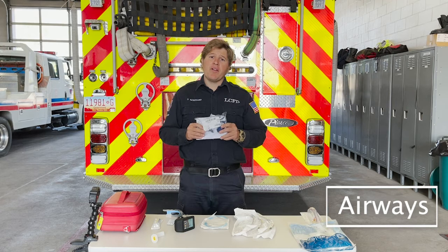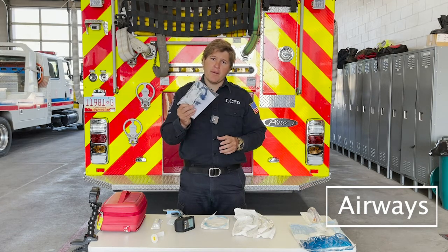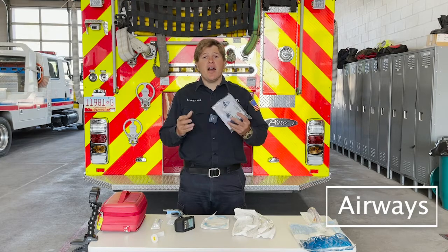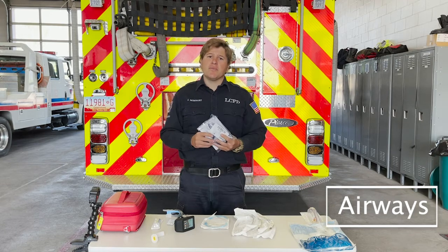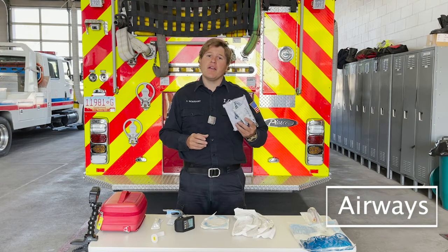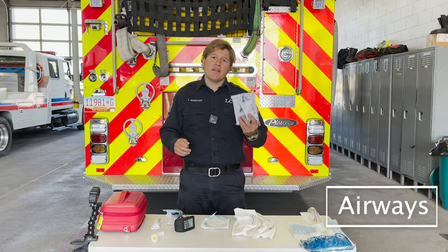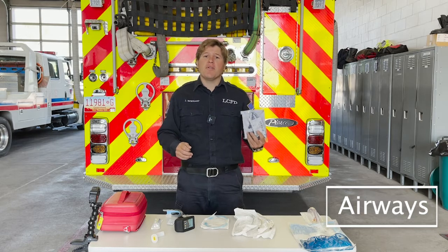Another thing you should prepare and have next to you that goes with our Airways is a tube tamer. We intubate a lot, and whether it's tape or a tube tamer, just have that means to secure that tube readily accessible, so that way you're not looking through bags trying to hold a tube into someone's airway and you're rummaging through a bag. So have someone grab this out, have it next to you, so that way you know exactly where it is.